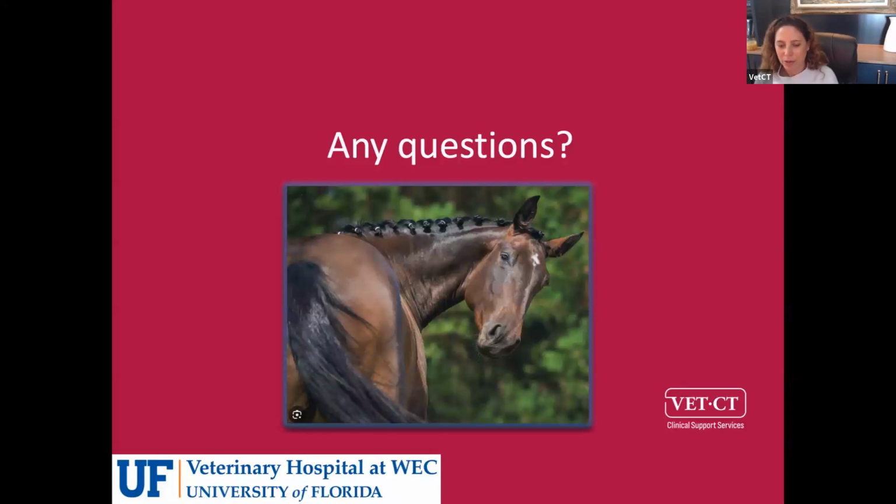So we're not doing standing myelography. We're just doing standing cervical spines. And in our scanner, we can only get to about C4 or so. And so in order to get the rest of the cervical spine, then they need to be recumbent. And in those cases, yeah, we can put the neck through their range of motion, but not standing. I don't think the horses would tolerate it very well either, unfortunately. It'd be cool though.